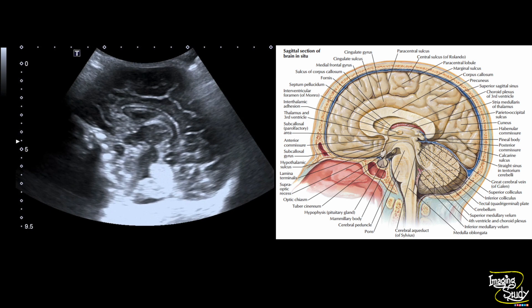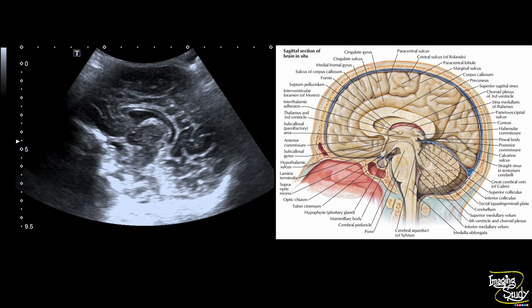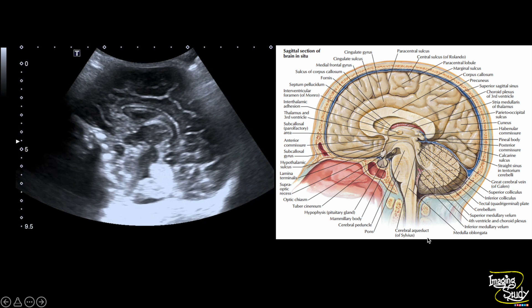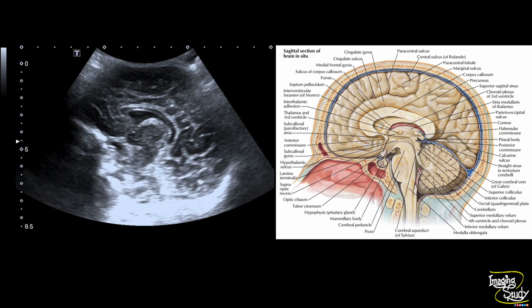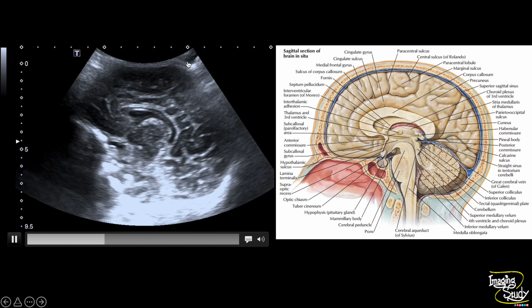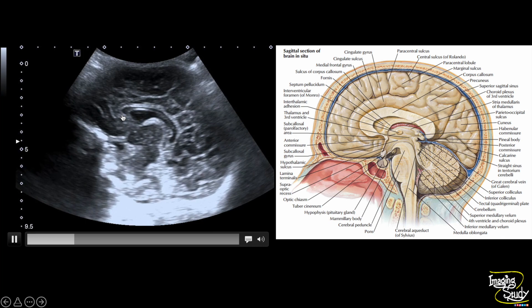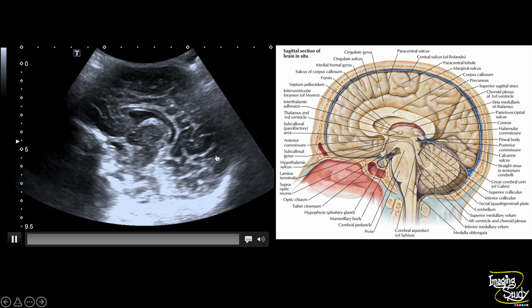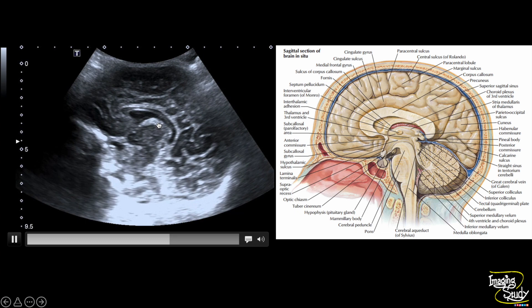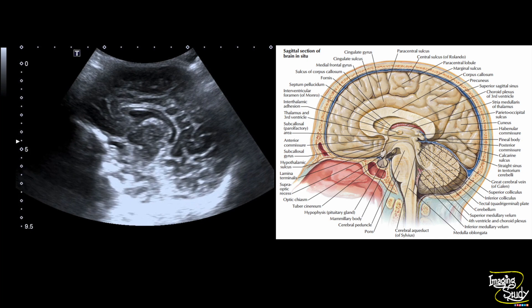Before starting the session, I'd like to give you an idea about what we are trying to see in brain ultrasound. We have the sagittal, coronal and axial planes to see the brain. On the right image you can see a sagittal section of the brain from the Netter human anatomy book, and the same image is shown on the left as a grey and white ultrasound image. This is the cavum septum pellucidum at the central part as an anechoic or black area. Superior to it is the corpus callosum, then the frontoparietal lobes, occipital lobes and the brainstem. This bright hyperechoic focus is the choroid plexus within the third ventricle area. This is the fourth ventricle area, and this bright area is the cerebellar vermis.